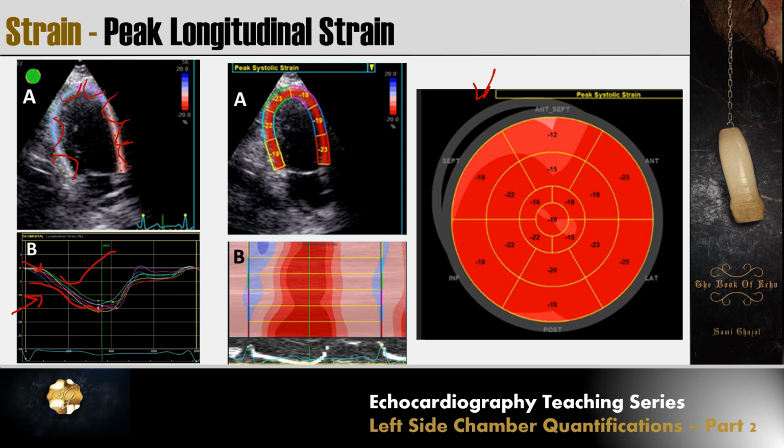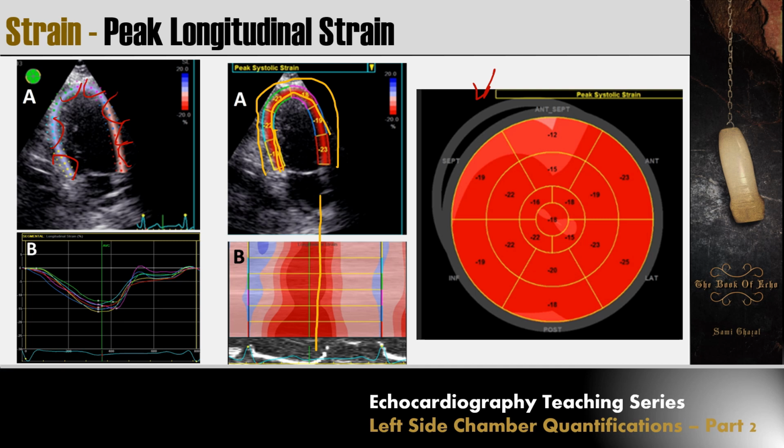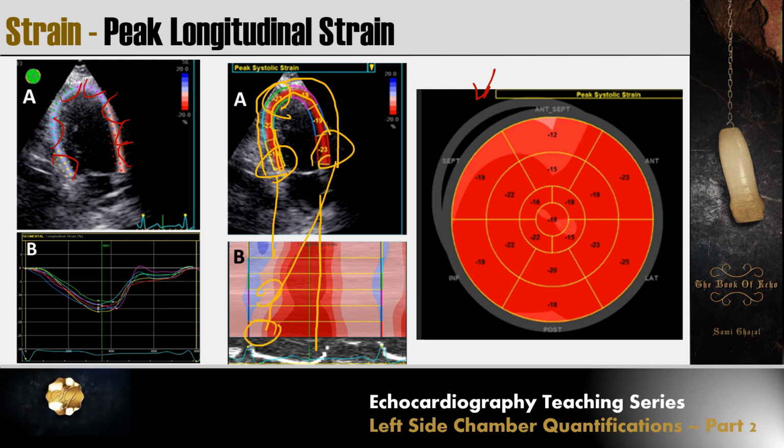The other way is to use something called curved M-mode. So imagine that if you straighten this line here, this orange line, make it straight, and plot it against time, you will have something similar to this. So this segment here is presented here, and this segment here is presented somewhere here. This segment here is presented here. So this is called curved M-mode.